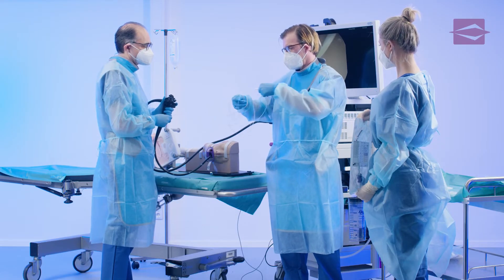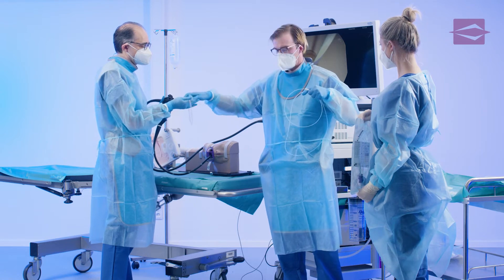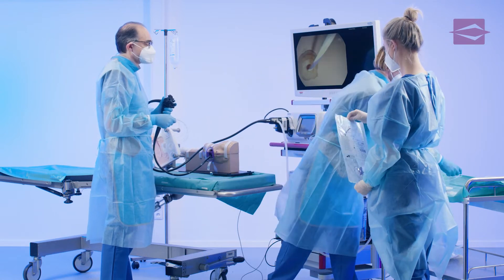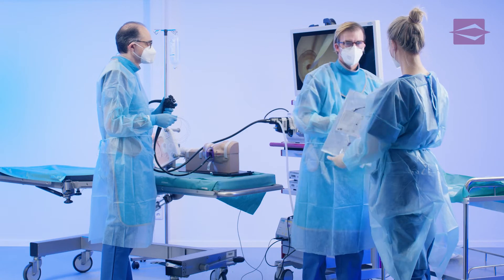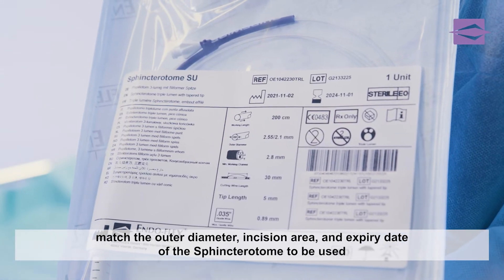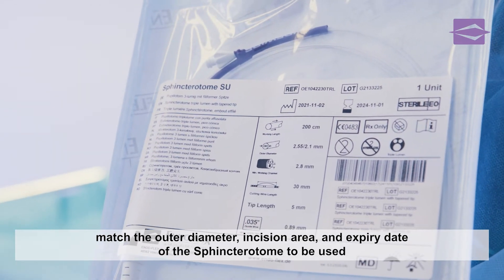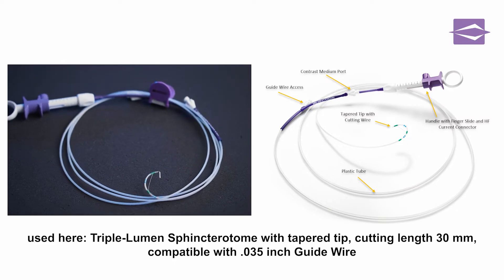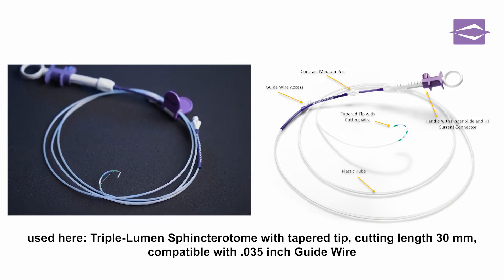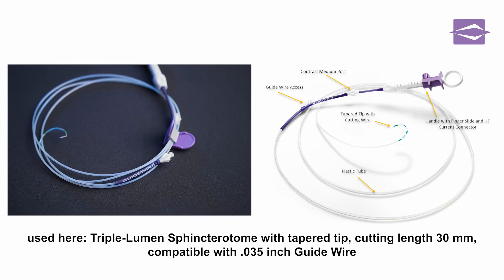After previous probing and cannulation using an ERCP catheter, this catheter is now removed via the guide wire that is already in place. The sphincterotome to be inserted is handed, and the relevant dimensions and the sterility expiry date on the label are being compared with the label on the pouch. In this demonstration, we use a triple lumen guide wire compatible sphincterotome with a tapered tip and a cutting length of 30 mm.